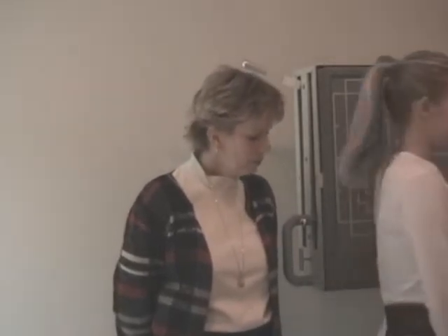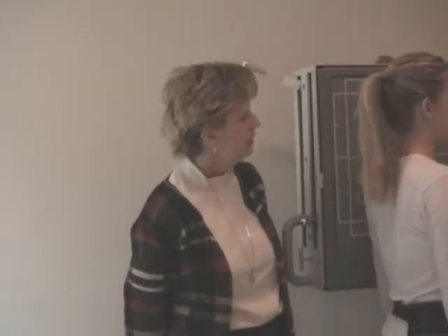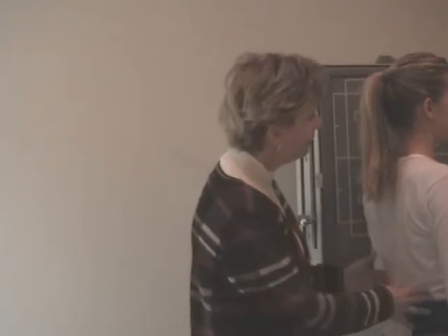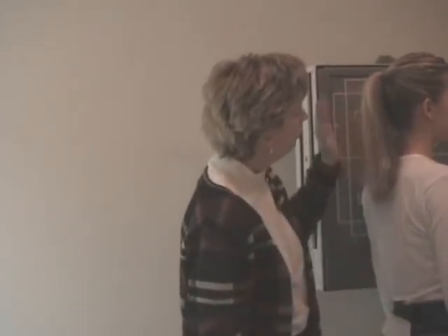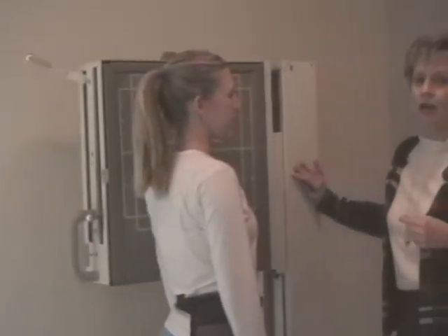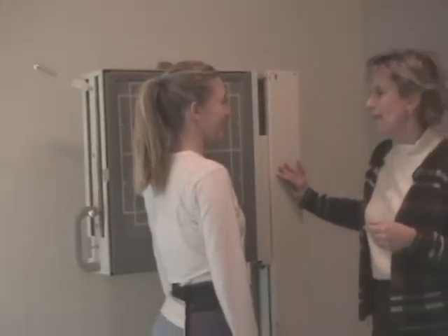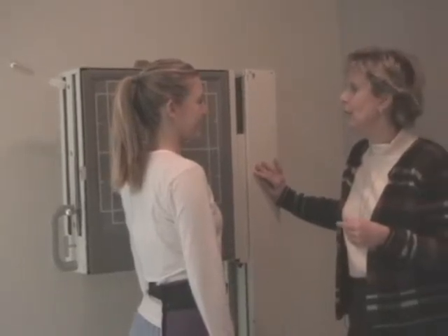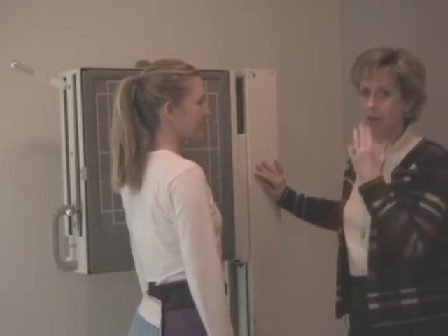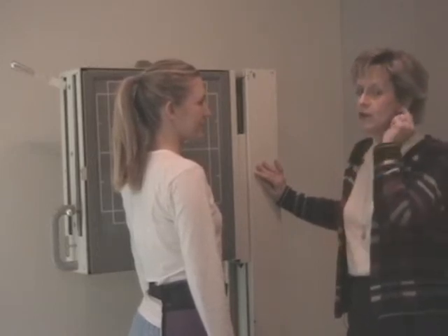So we've got our room set up for a lateral patient. Let's talk about patient positioning or dress first. She will be in a lateral position, and our model elevated her hair for us into a ponytail. We don't have earrings on, and hopefully she doesn't have any body piercings. If you can, hopefully there's what they call a plug, Kristen, for the tongues. Okay, you would have a plug in there instead of the metal, because things are going to get in the way. Earrings need to come off.